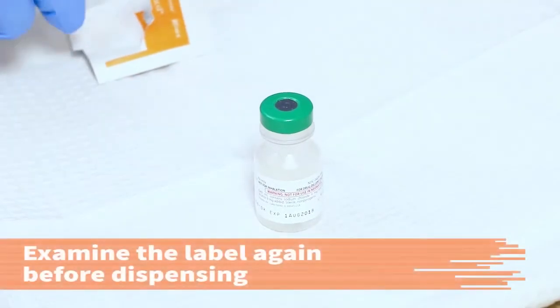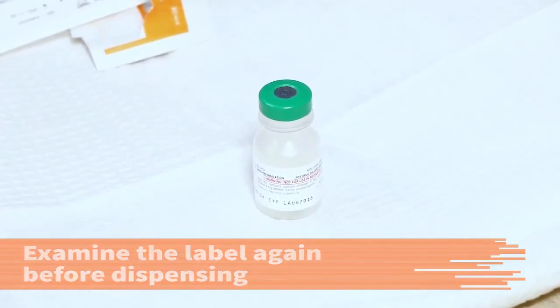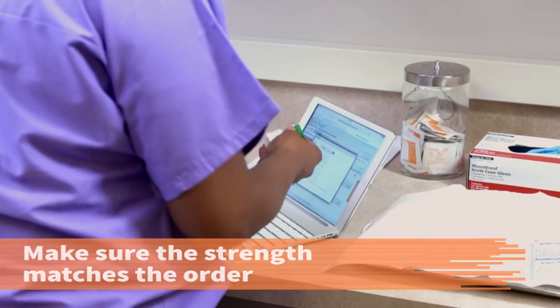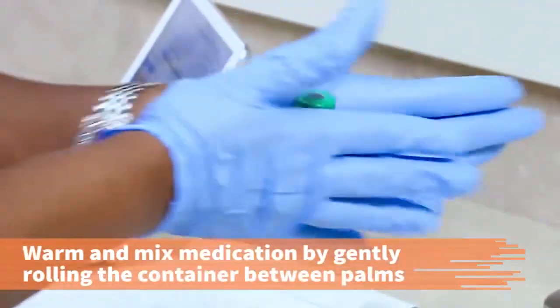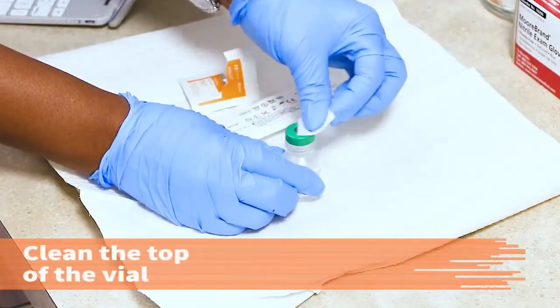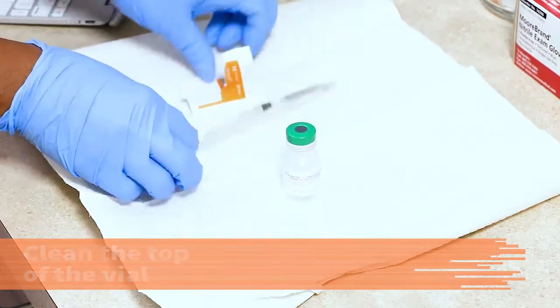Examine the label on the vial of medicine again just before dispensing the ordered dose. Make sure the strength on the label matches the order, or that you dispense the correctly calculated dose. Warm and mix refrigerated medications by gently rolling the container between your palms. Clean the top of the vial with the alcohol wipe using a circular motion. Place the vial on a flat surface.